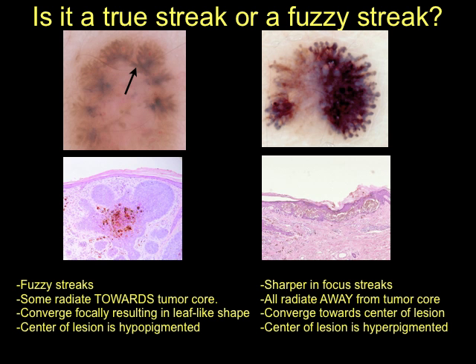The lesion on the left is a basal cell carcinoma with fuzzy streaks. Notice that some of the streaks, as highlighted by the arrow, are radiating towards the tumor itself. Also notice how the streaks are converging focally at the periphery, creating the so-called leaf-like structure, and that the central portion of the tumor is hypopigmented.